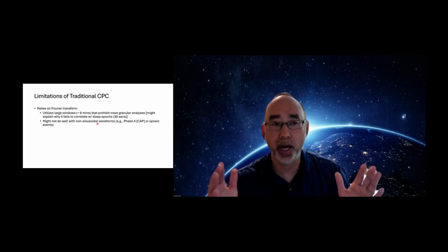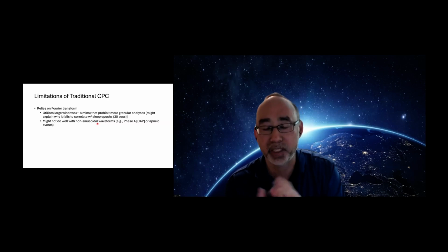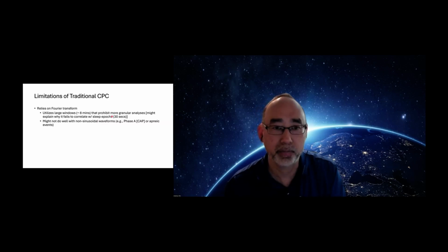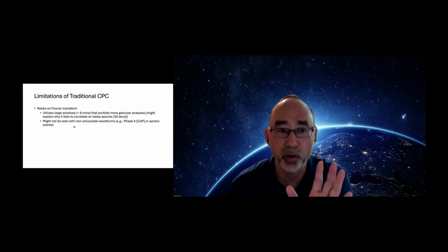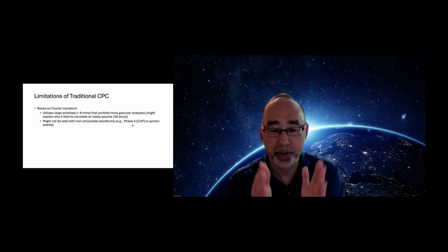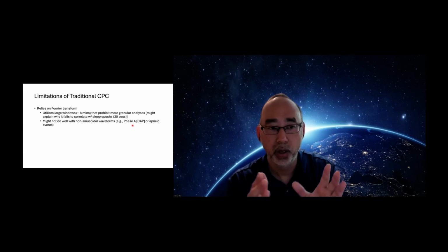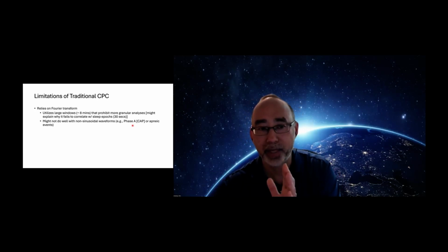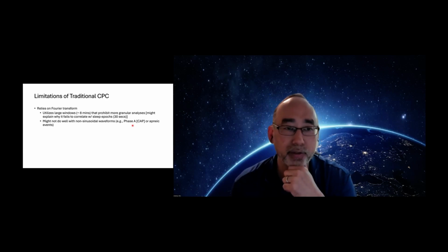This might explain why it may not correlate that well with the staging that you get from the sleep epochs, because the sleep epochs is about 30 seconds. Fourier transform also doesn't do terribly well with non-sinusoidal waveforms. For example, the phase A episode during CAP happens at an instantaneous time. Obviously, it lasts about 15 seconds or so, but then you have a lag period about that. And so that waveform is not necessarily sinusoidal. And so the Fourier transform doesn't necessarily do all that well for that.